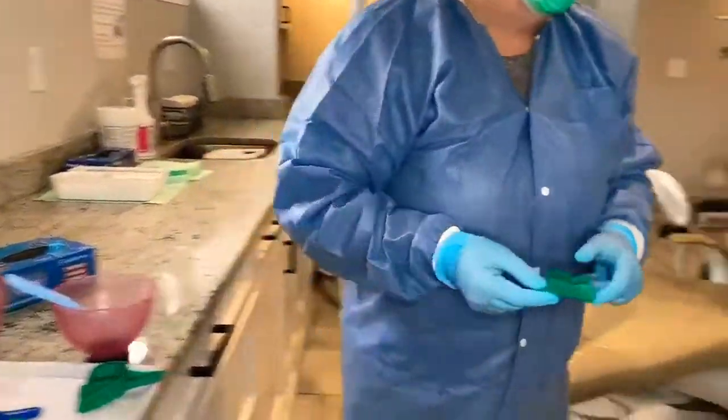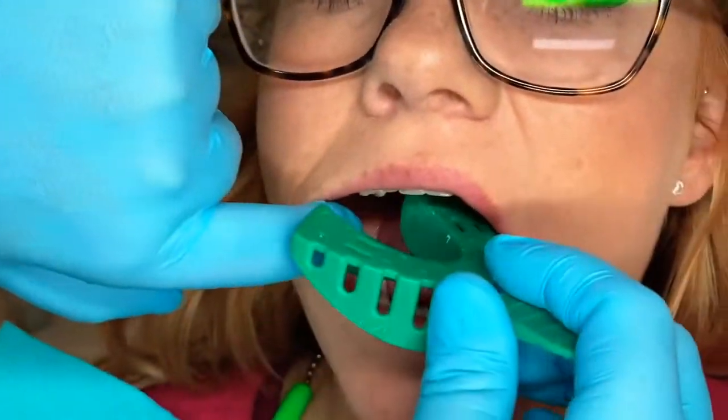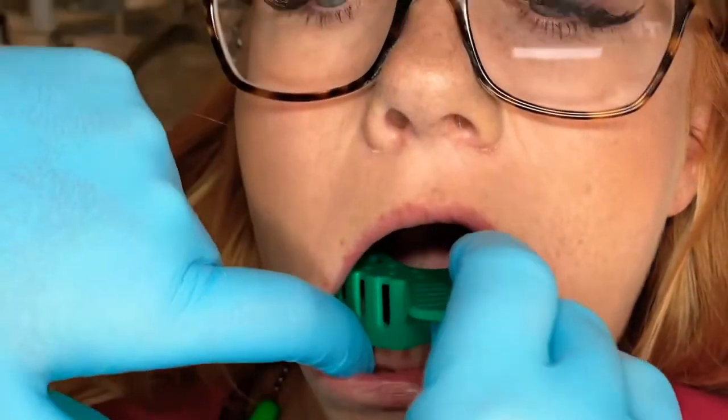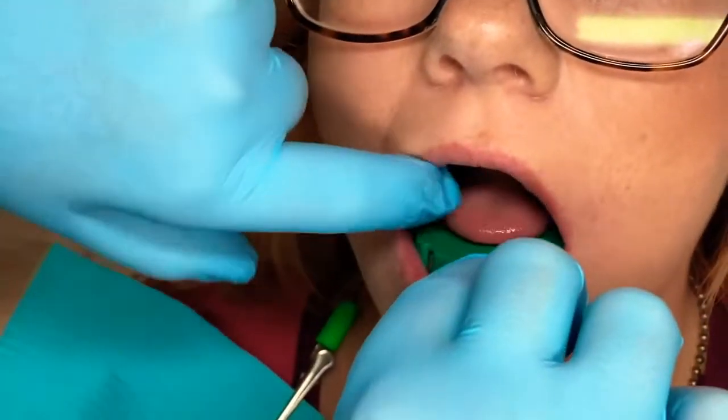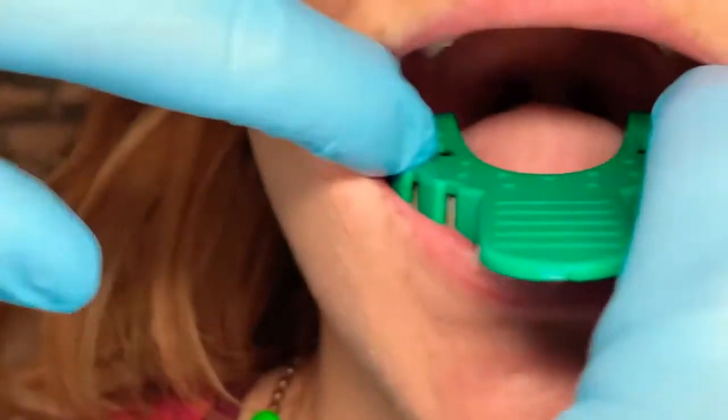I'm going to take the lower tray and try this one in too — she has tori on the bottom. Retracting, same way to try it in. I'm going to keep her lip here. Lift your tongue for me. The tray is not rubbing and the back molar is covered.